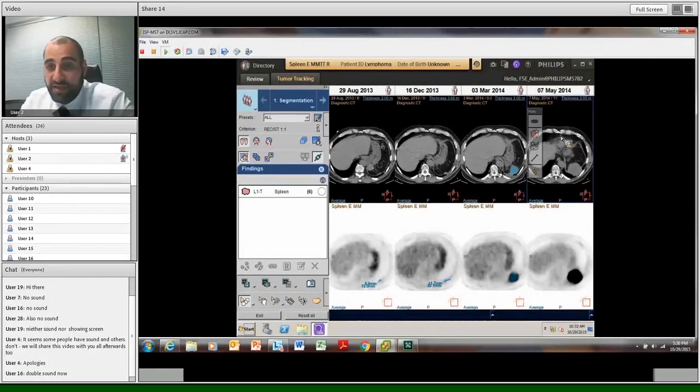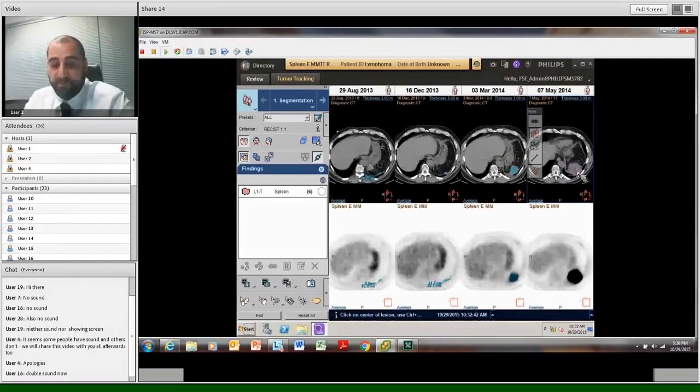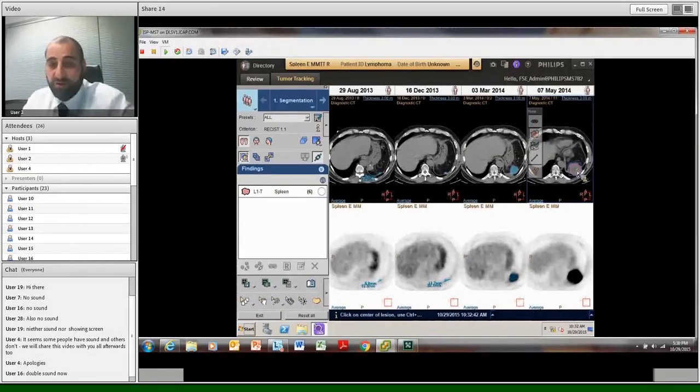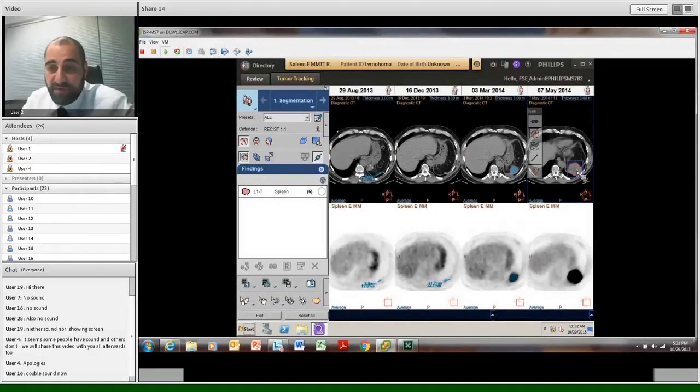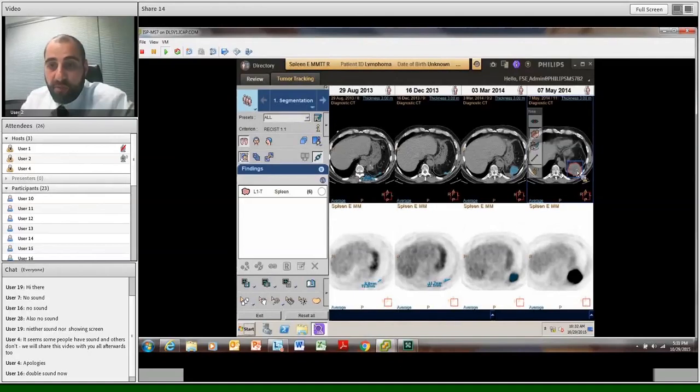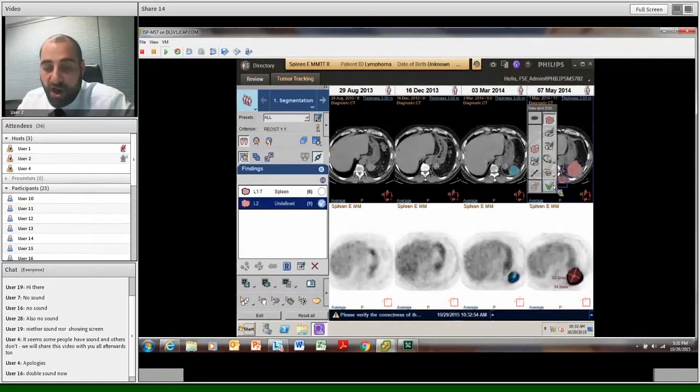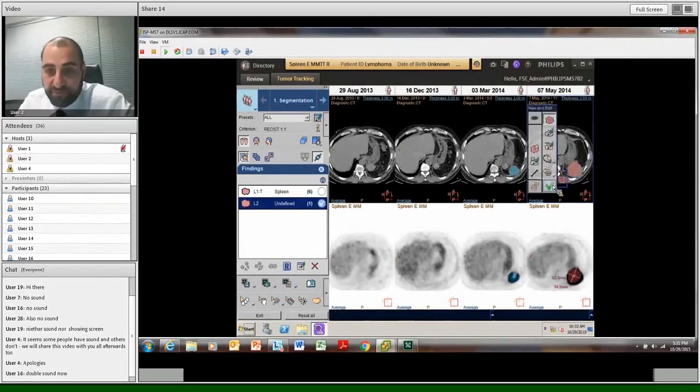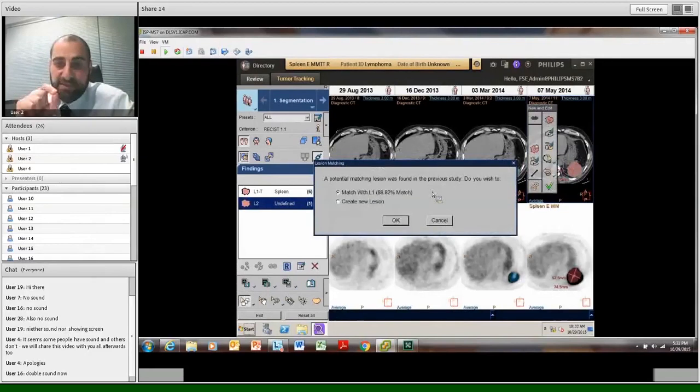Above, we have the CT images, which is a macroscopic view of the tumor. Inferiorly, when we look at the PET, we're looking at microscopic patterns of tumor in activity. So being able to correlate those two during both multimodalities gives us greater confidence to say that this has become an active tumor and it's grown over time.